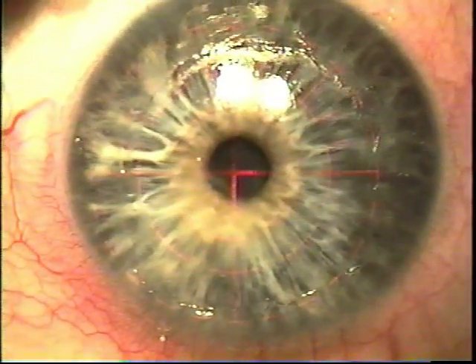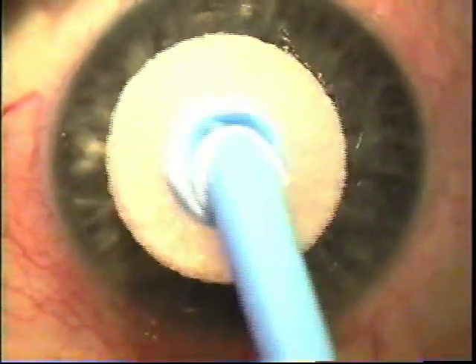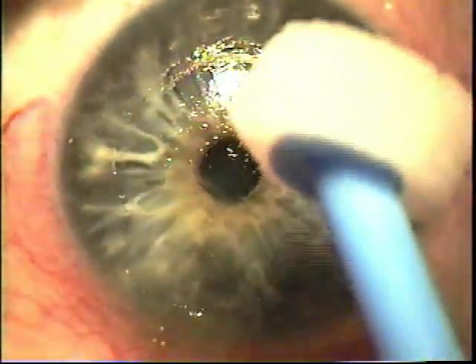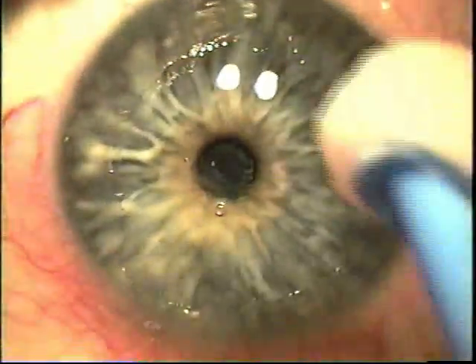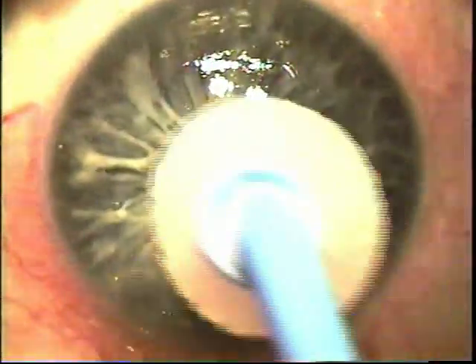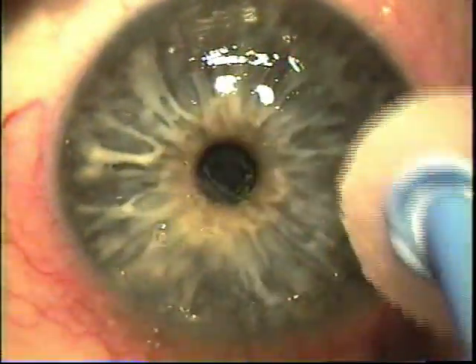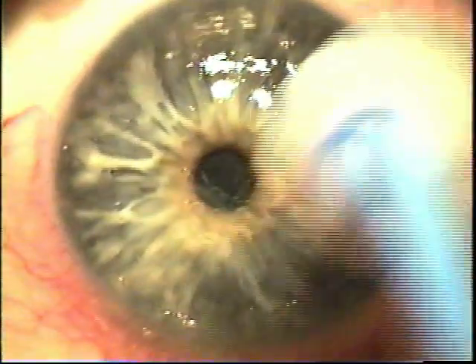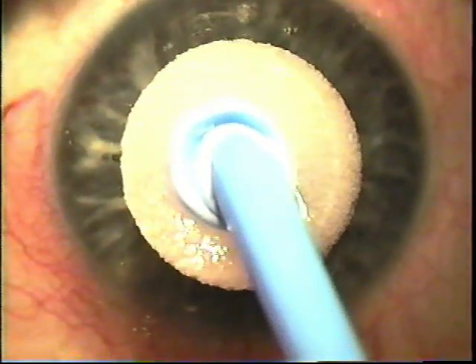At this point we will apply mitomycin C for about 30 seconds. You may even rub the surface or gently place this disc-shaped sponge soaked in mitomycin C so it applies to the central cornea.